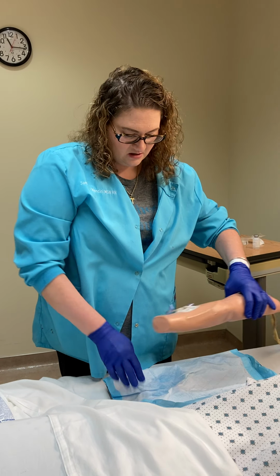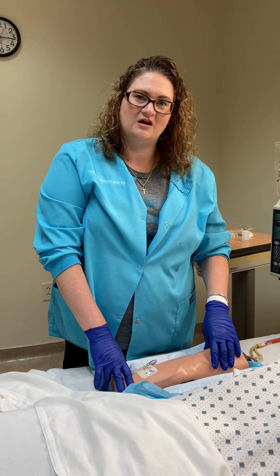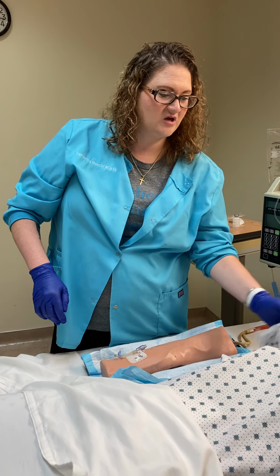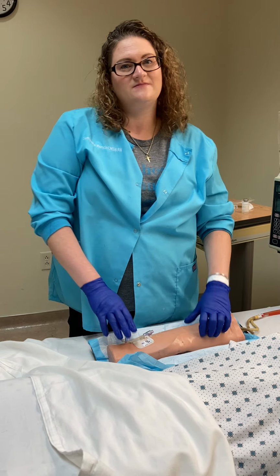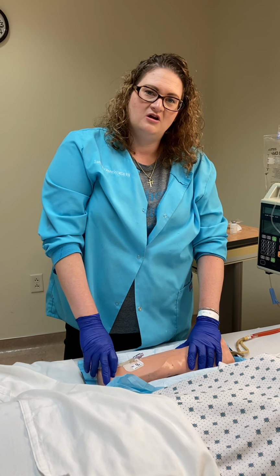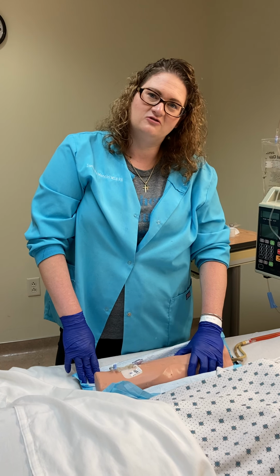Just as a word of advice from a lot of seasoned nurses. When they come on shift, a lot of times what we do is when we go in to first see our patients, we like to take our flushes and our alcohol swabs in and check our IV to make sure that it's patent before we get started with med pass. Because if we lose an IV, we can try to get one in.